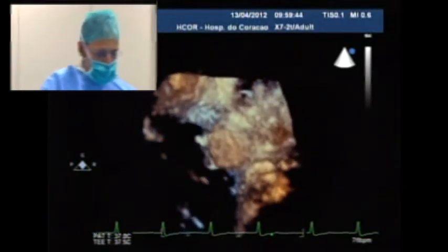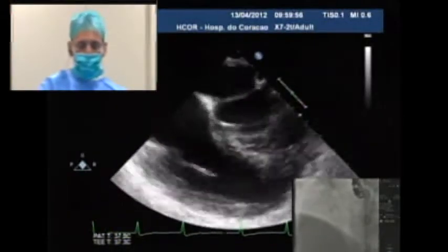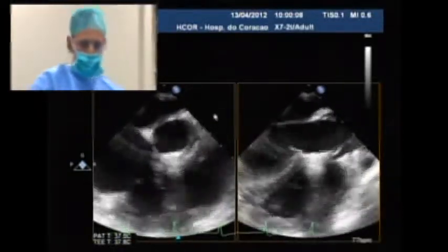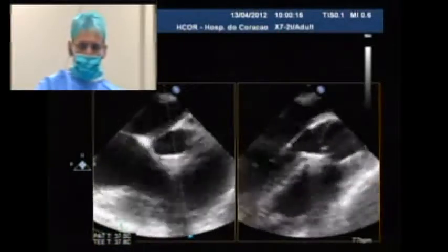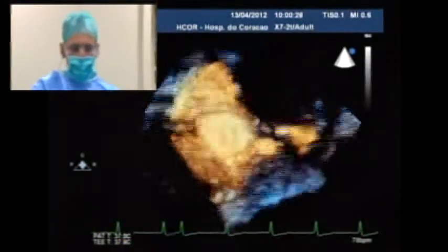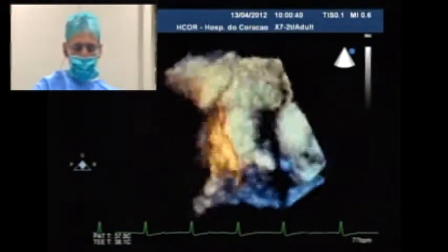Thank you. In fact, one of the requirements for perimembranous VSD closure is to have a distance from the aortic valve of 4 millimeters in order to avoid interference with the aortic valve, causing malfunction of this valve. However, we've seen some patients with less of a rim, less than 4 millimeters, in whom we have put the asymmetric device, the type 2 or 3? The type 3 device. The type 3 device you can see on the screen in the factoid slides. It has the upper portion of the left disc kind of smaller. It goes upwards only 0.5 millimeter from the waist. So this is a way to avoid protrusion into the aortic valve.